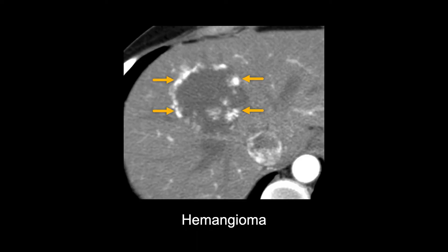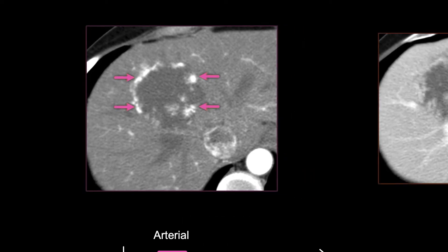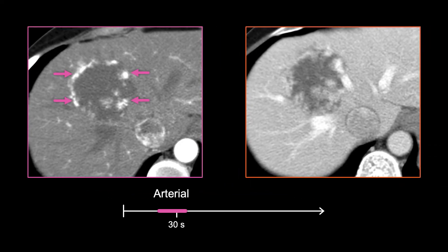The second is a hemangioma, which in contrast to a cyst has internal enhancement that will fill in over time. These are benign and relatively common in the liver. For hemangiomas in the arterial phase, the enhancement starts as small nodular areas along the outside of the mass, which grow and fill in toward the middle in the portal venous phase. Seeing this progression helps confirm the diagnosis.